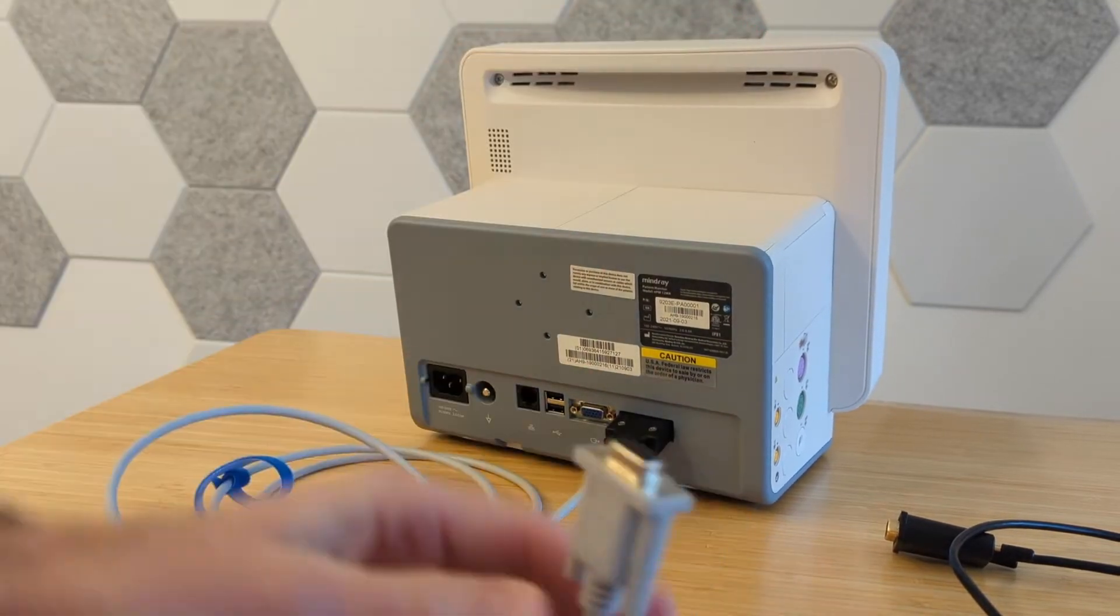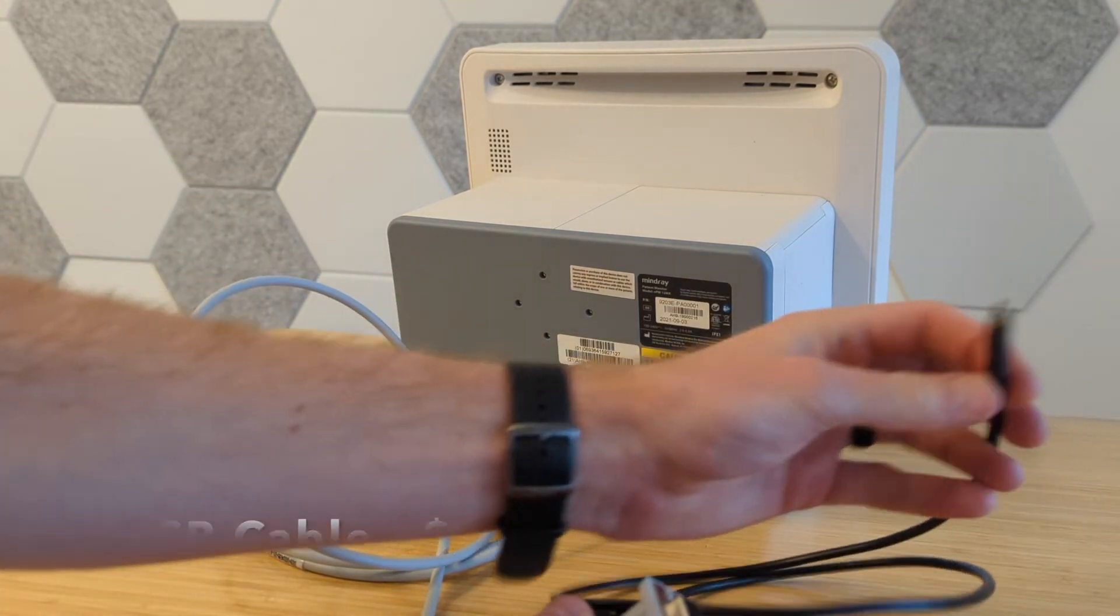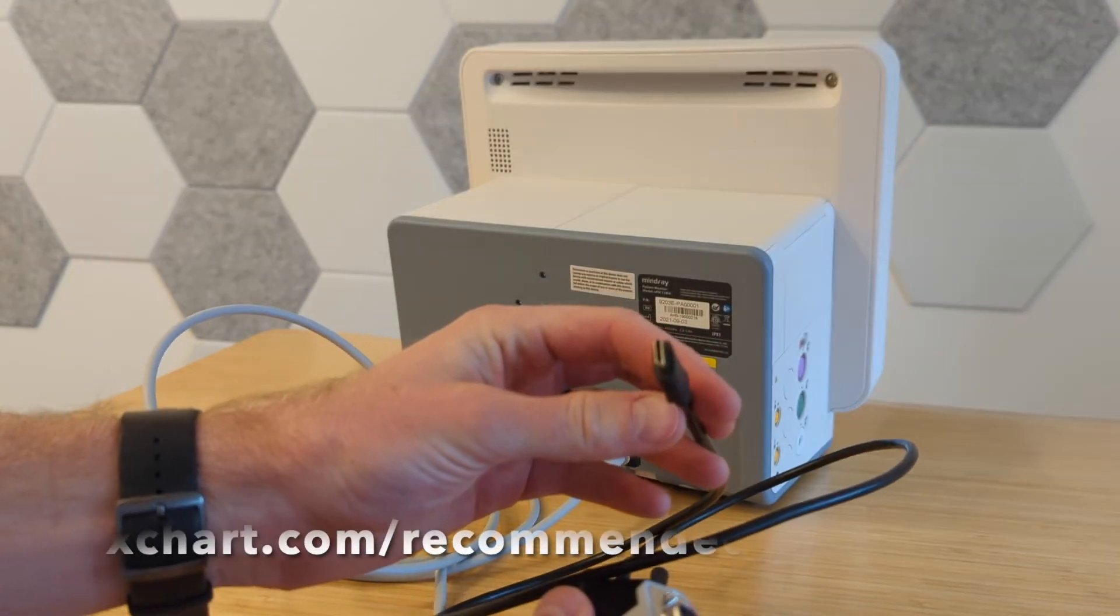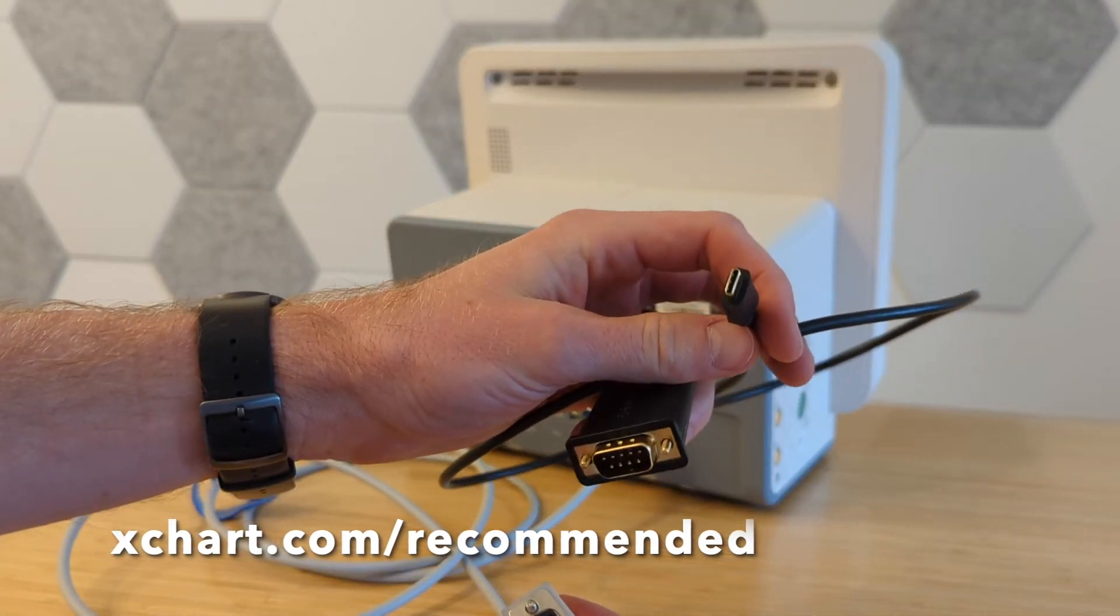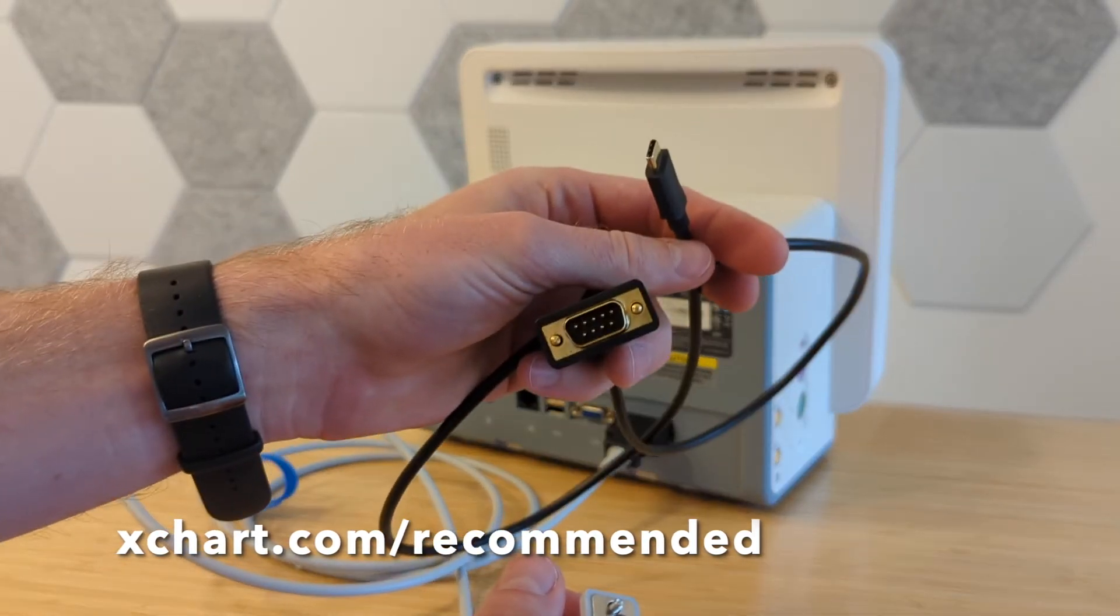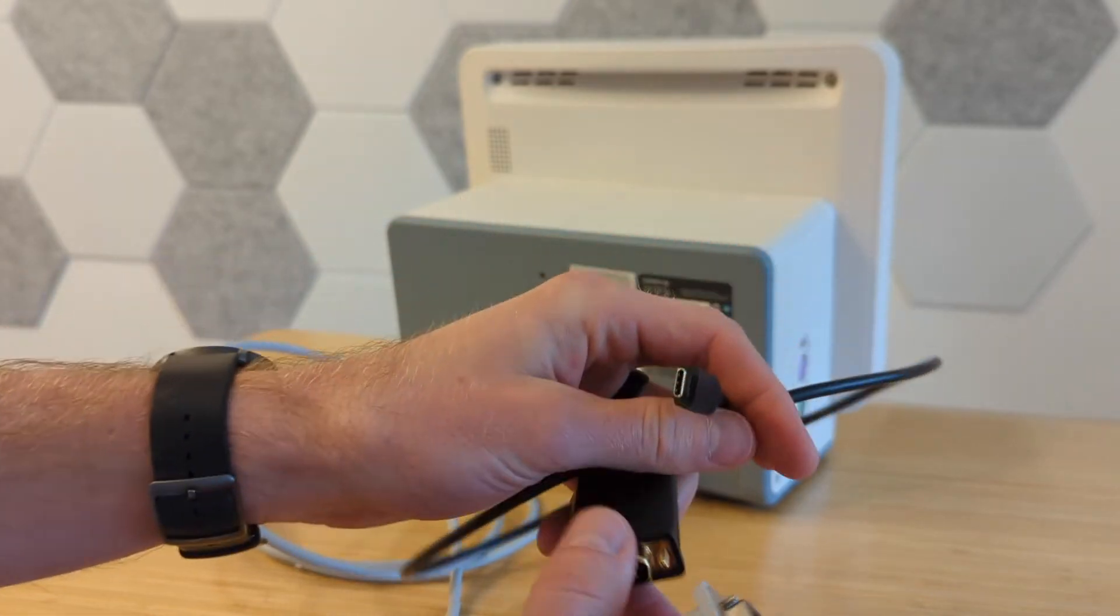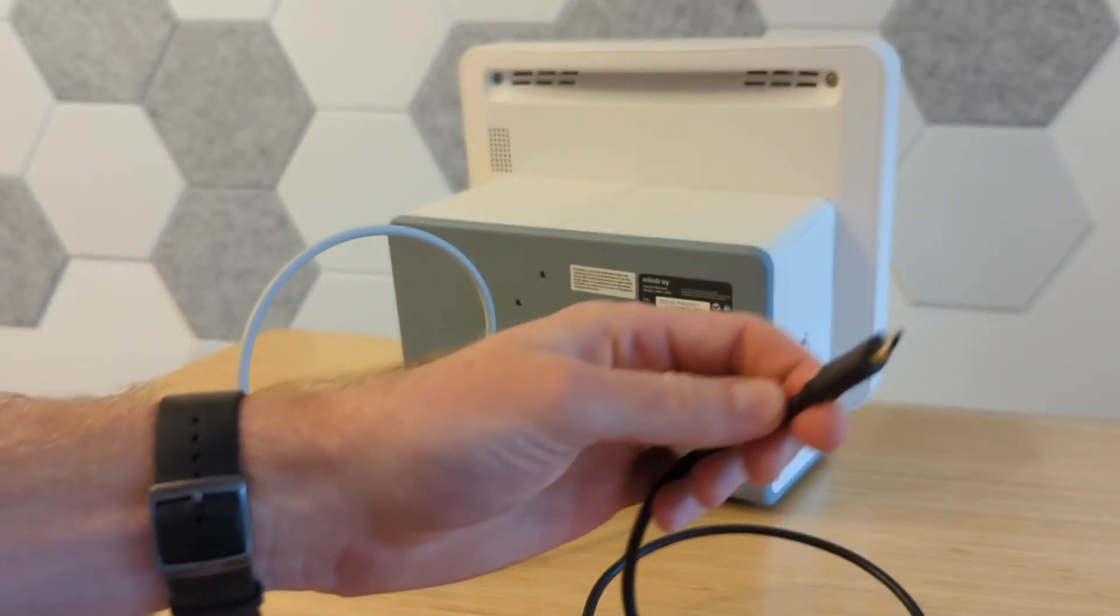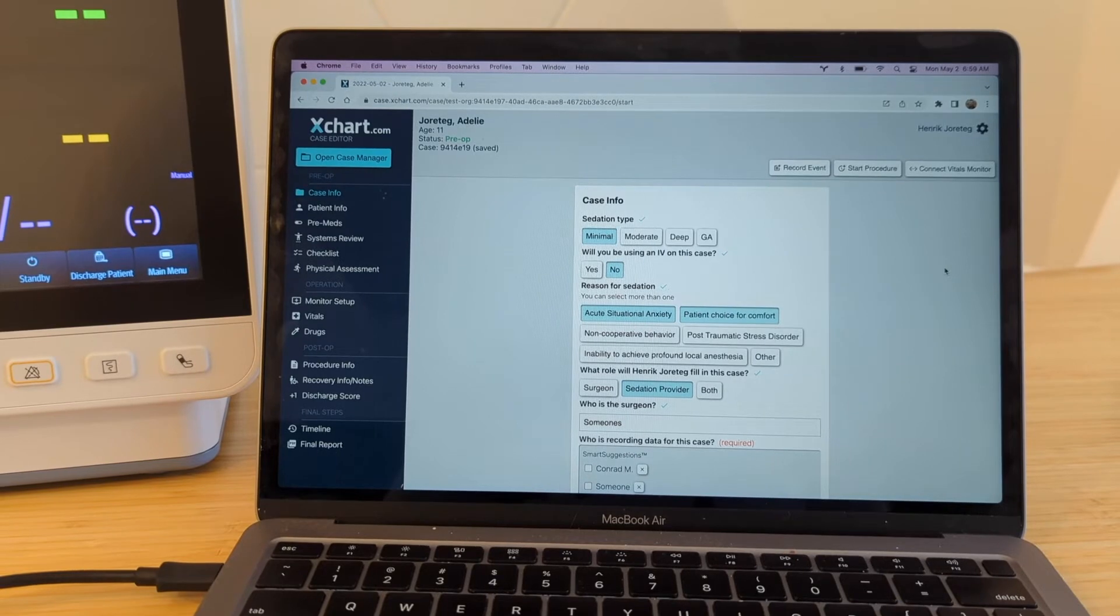And then from that, you just need a cable to take from serial to something you can plug into your laptop, which is USB or USB-C. And if you go to xchart.com/recommended, you can see a list of links to Amazon for various cables that we recommend that have worked well for us. But this is just like a standard kind of Amazon type piece you can get. It doesn't need to come from MindRay or anything. And you'll just want to make sure that you have a good snug connection between these two. And then you can plug this directly into your computer.